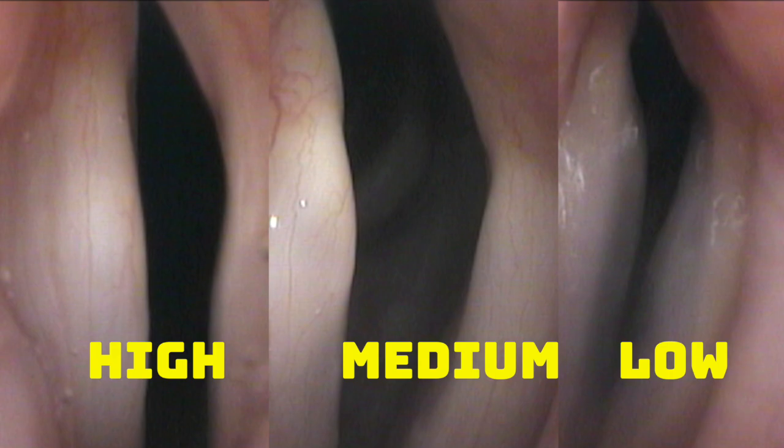Here we have three images at high, medium, and low pitch. In the leftmost image, the right vocal process is near the midline, and the left vocal process is canted laterally. As she drops down in pitch, moving across the screen, the left vocal process gets canted further and further laterally, giving her a larger and larger gap, although the right vocal process actually pushes harder and harder at lower pitch, trying to adjust the compensation.